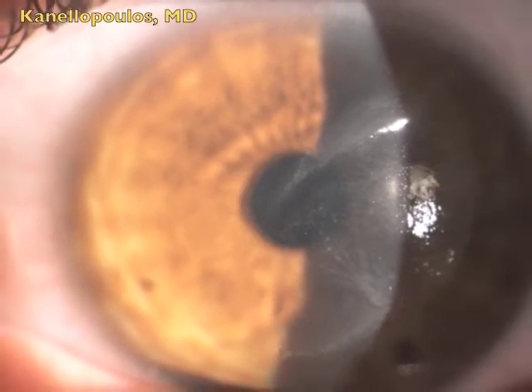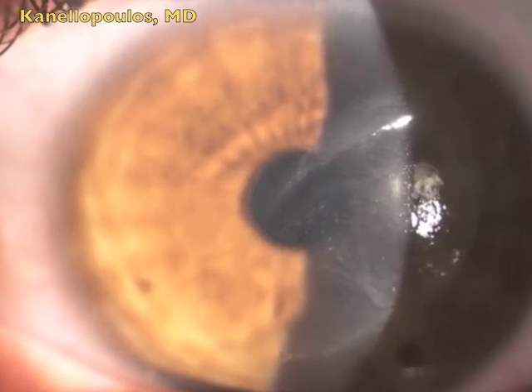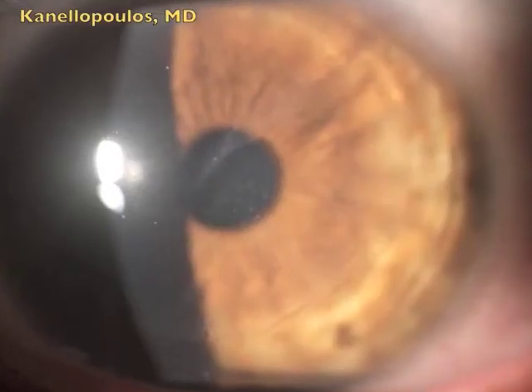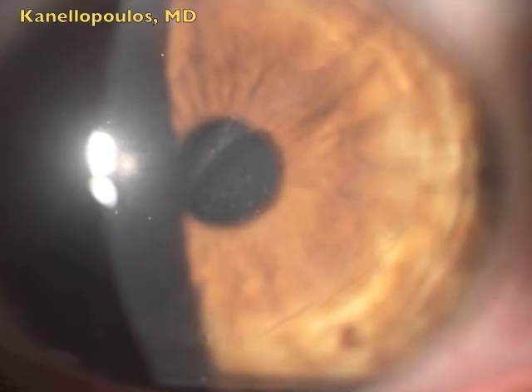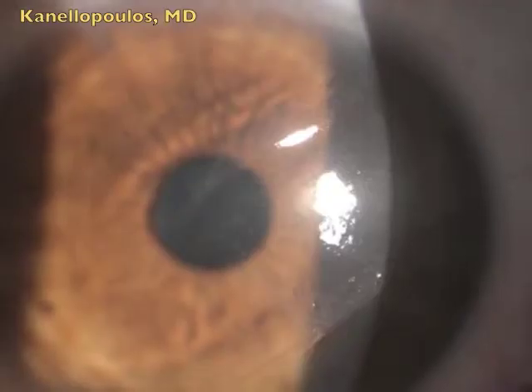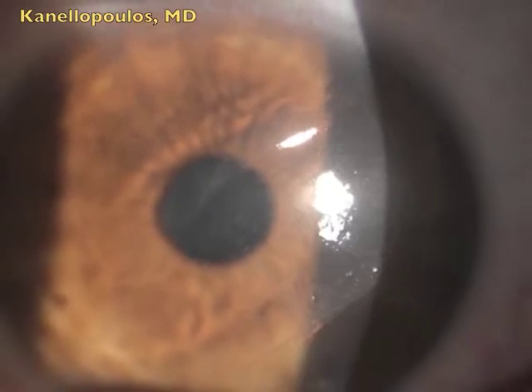This is a very, very severe epithelial ingrowth in a LASIK case that was done eight years ago with a keratome elsewhere. You can see that central fold that is full with epithelial ingrowth underneath it. Vision is down to 20/80, best corrected 20/80.